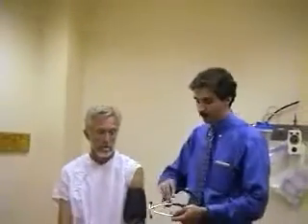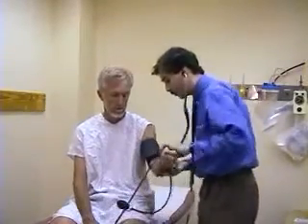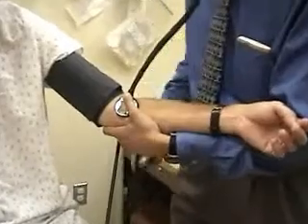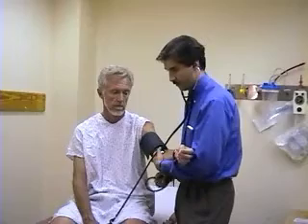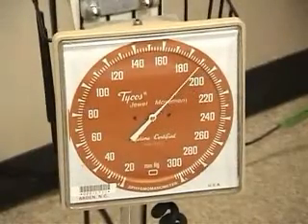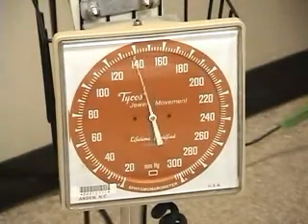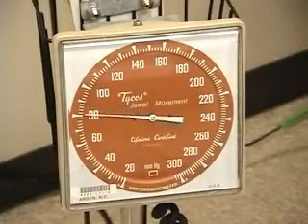Now I'm going to listen for the blood pressure using the stethoscope. If you have a stethoscope with both a diaphragm and a bell, you want to use the bell to better hear the blood pressure. I'm going to support the patient's arm and place the stethoscope over the brachial artery. I'm going to pump up the blood pressure cuff to about 20 millimeters above the palpable systolic blood pressure, then slowly let the cuff down at about 2 to 3 millimeters per second. The first two sounds you hear will be the systolic blood pressure, and the final sound will be the diastolic blood pressure.